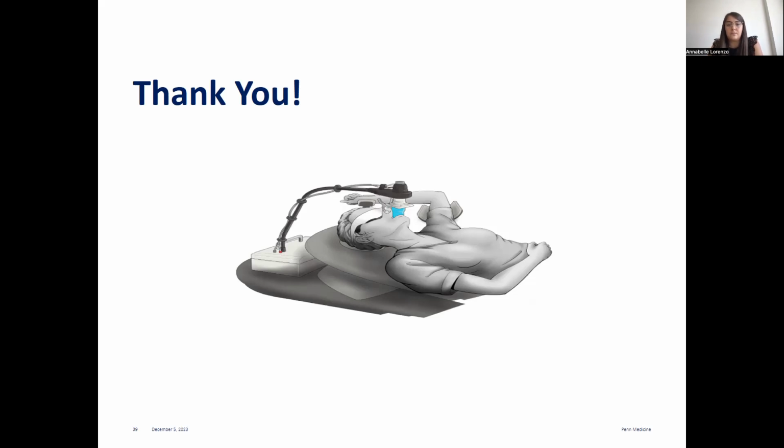We don't do SDX on any head and neck treatment. The only ones that we use SDX for are the lymphomas, and they get put on the 5-point board. Our 5-point board has a part of the board, before the mask starts to connect, that the device fits nicely on. And we just open up the face of the mask. Got it. Is it a CIVCO board or QFix? QFix. Yeah, it's the 5-point from QFix. Got it.